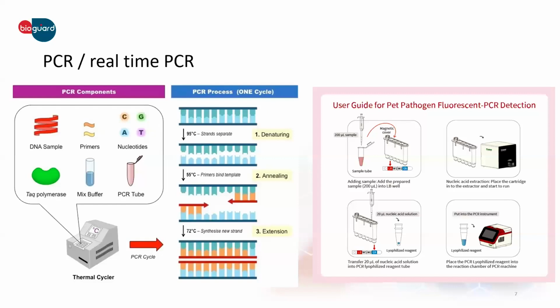Nowadays, more and more real-time PCR, even in-clinic real-time PCR, are available on the market, so using real-time PCR in clinic is more convenient.